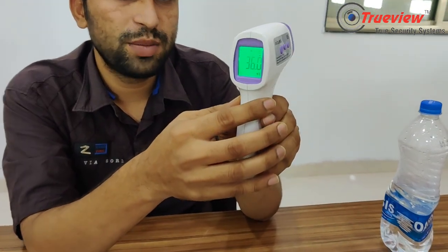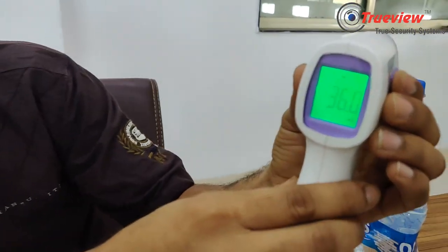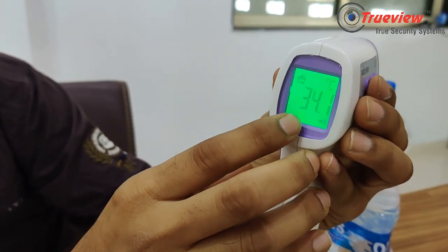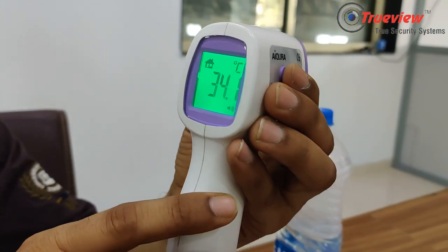If you want to detect the whole room temperature, you can check it. Just press the mode button, and automatically it switches to room temperature mode. You can see 34.1, which is the area or room temperature.